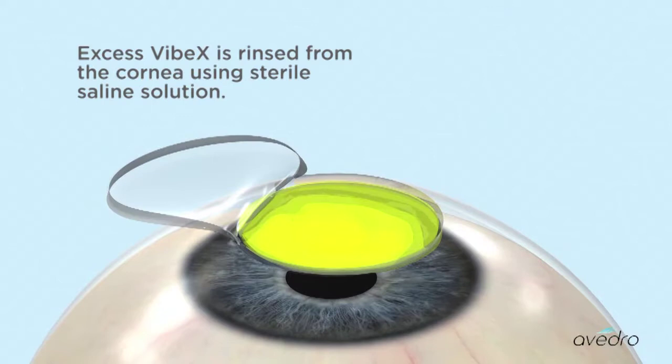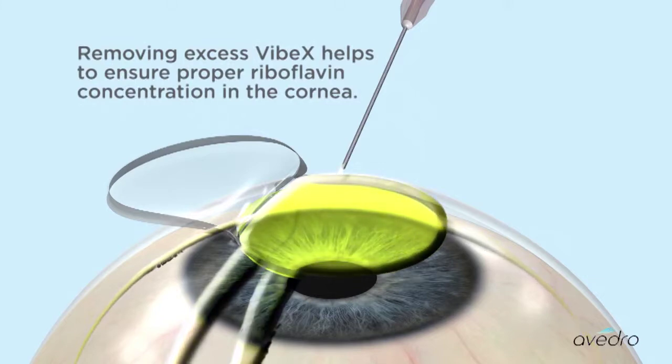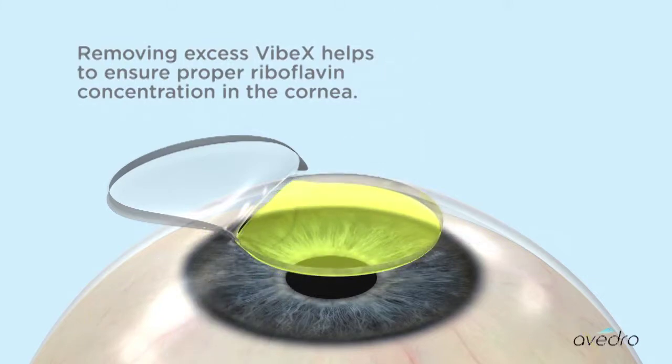Excess Vibex is rinsed from the cornea using sterile saline solution. Removing excess Vibex helps to ensure proper riboflavin concentration in the cornea.